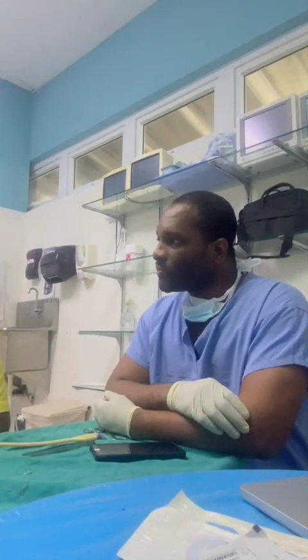This afternoon we had a 15-minute demonstration session with my volunteer, Dr. R. Thank you very much, sir. And what we demonstrated was sutures and suturing technique. We went through different types of sutures and classification, as well as the interrupted and continuous stitches, and principles and techniques for suturing.